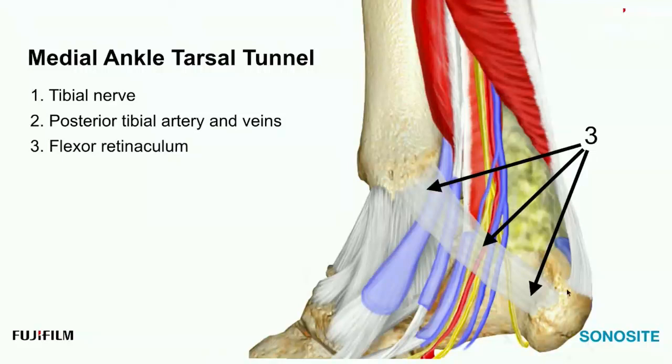Then lastly, we have this flexor retinaculum from the tibia to the calcaneus, and that's our proper tarsal tunnel. But it's all these other factors like the tendons, the joints that can have ganglion cysts, space occupying masses like loose bony fragments can occur in these areas. So if you're not seeing nerve diameter changes, one thing to look for are ossifications in the ankle, old scar tissue that is calcified and clinging itself to the nerve against the flexor hallucis longus tendon, for example, or flexor digitorum rarely. I don't see the nerve branches resting up against flexor digitorum necessarily as much as I do flexor hallucis longus. But right here at that retinaculum is the typical choking point.